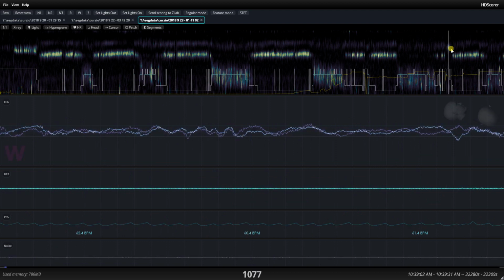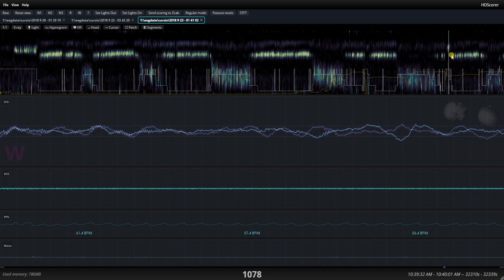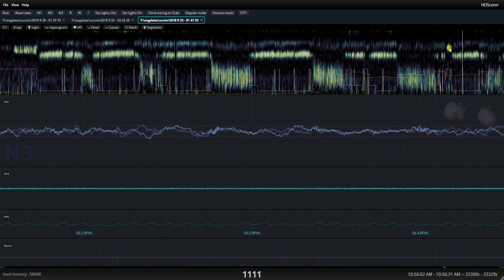This patch of alpha waves correctly got scored as wake. You will notice that it's very hard to say that this is alpha. It's something I can see visually, but to get a machine to see it, it's very tough. For example, you can see that this alpha is occurring at the same level as theta, and theta and alpha look identical in width, in thickness. Not only that, but during REM, theta oscillates, so it's not very stable in frequency. It's much more stable during sleep cycles.